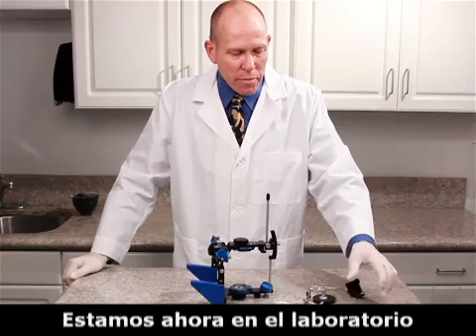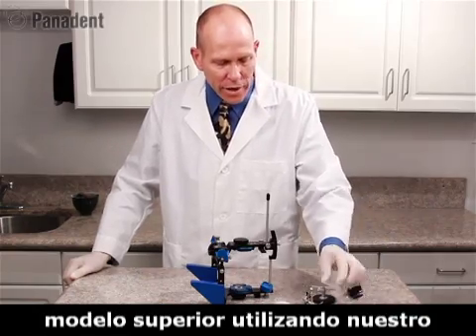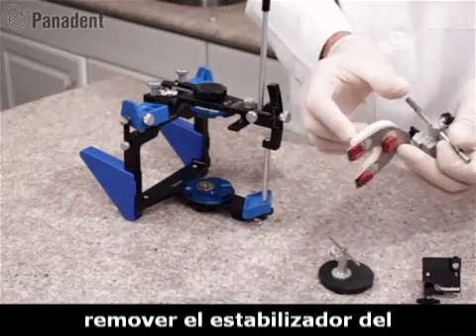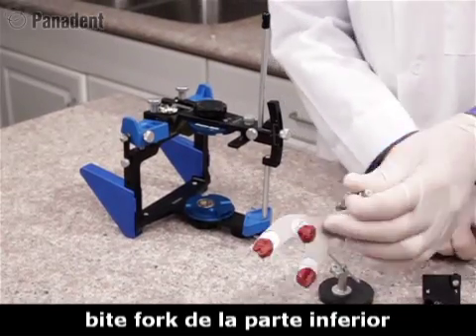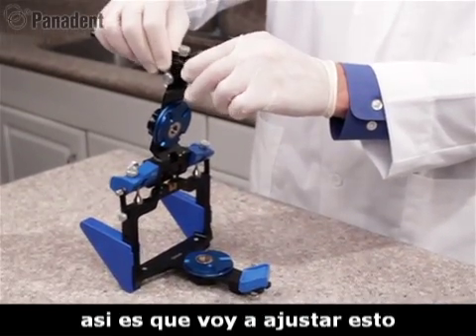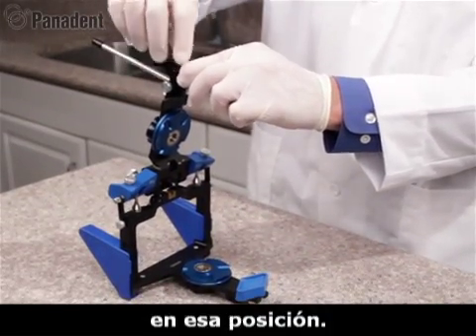We're now in the laboratory getting ready to mount our maxillary cast using our bifork assembly from the face bow. In preparation for that, we want to remove the bifork stabilizer from the bottom of the bifork, and we want to set our incisal pin at zero, adjusting it to the zero mark and tightening it in place.